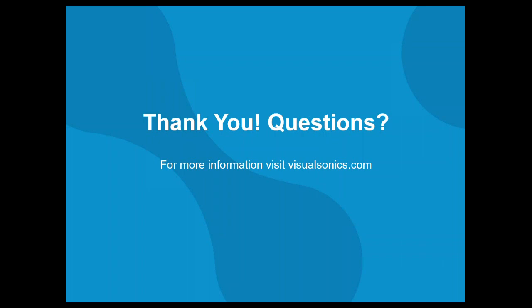Stephen, do we have some questions? Hi, yes, we do. Sorry, a little delay there. Great presentation, Sandra. Thank you for the overview. It's really in depth and really shows. I'm really sorry it took a bit longer than expected, but as I said before, we didn't have a contrast and CQ webinar in a long time, so there was a lot of information to get through. Yeah, it's true, and there's always lots to talk about, especially with this subject. You can get pretty deep if you want to.